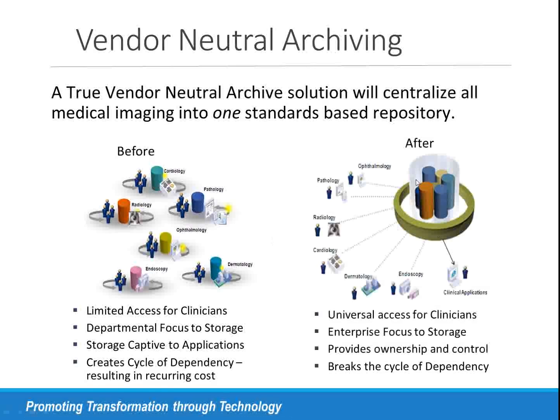Whereas today, the vendor-neutral archive is in the center with all these various ologies that surround it, and all the data feeds into a central image archive, which is fully replicated across to a site that allows for disaster recovery, high availability, and all those things that we were after.